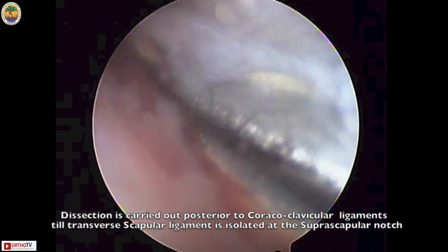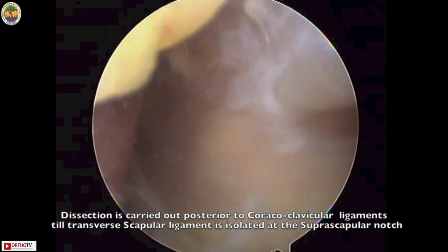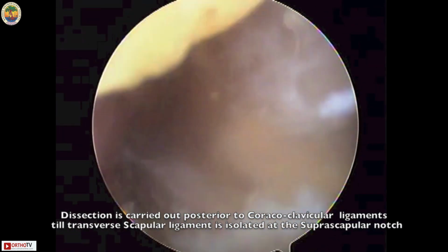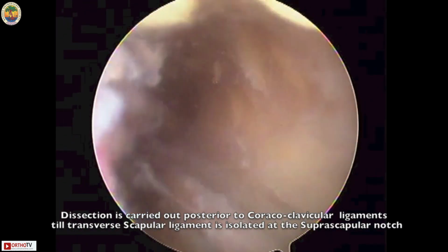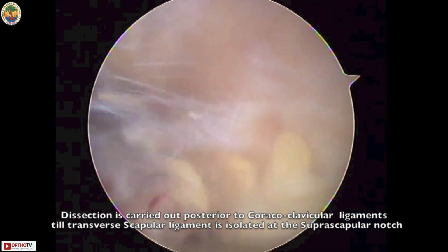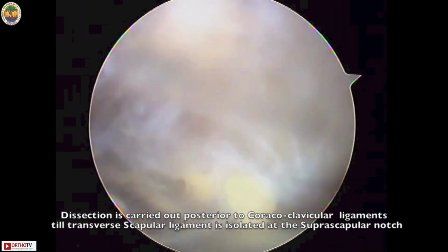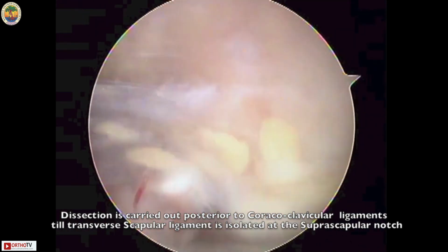Dissection is then carried out posterior to the coracoclavicular ligaments medially till the transverse scapular ligament is isolated at the suprascapular notch. The transverse scapular ligament is visualized clearly and tissues are cleared medial and lateral to the ligament.